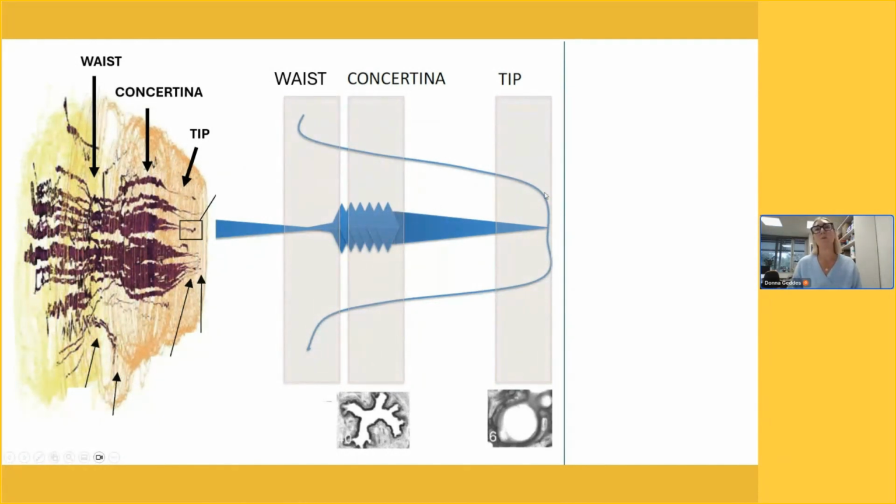And then we also need to overcome this narrowness at the tip with vacuum to enable milk to flow. You can see a nice diagram here actually of the concertinaed up duct, and when it's not concertinaed, you can see it's nice and smooth, so it's not going to provide resistance to flow.